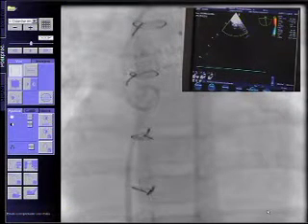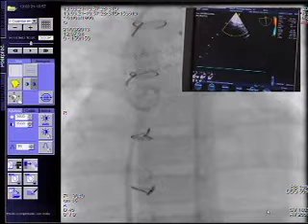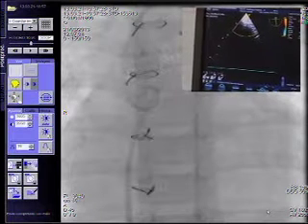Vamos con la guía de 0.20, una guía de 0.21, yo creo. Para el cutting es 0.18. ¿Una teflonada de 0.18? Una de 0.18 de intercambio, larga. Sí.